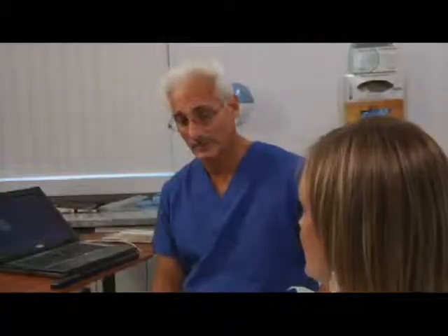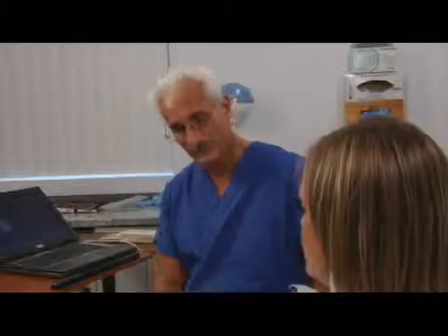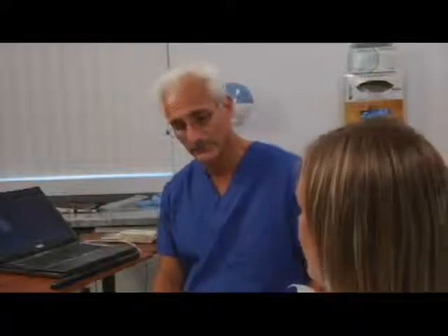So Caroline, now that we've straightened out your occlusion, what's different about it? How does it feel different than from before we treated you? It feels a lot different. It feels good. Definitely align better. I can feel it in the back, less pressure. So it feels lighter in back? Yes. And does it feel like you can close and your teeth fit together? Yes. Yes. And did it feel like that before we did this?